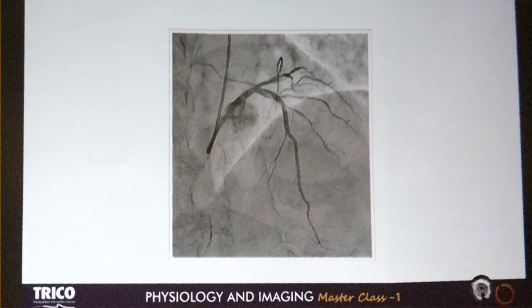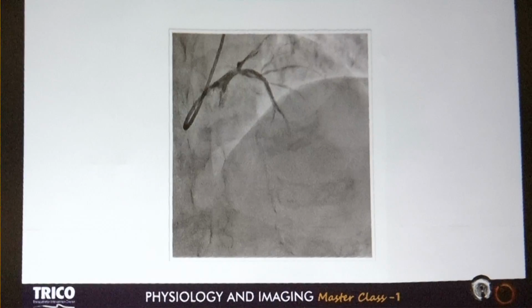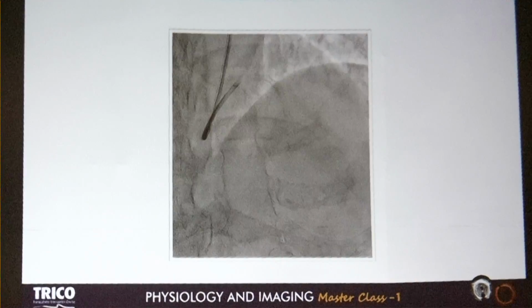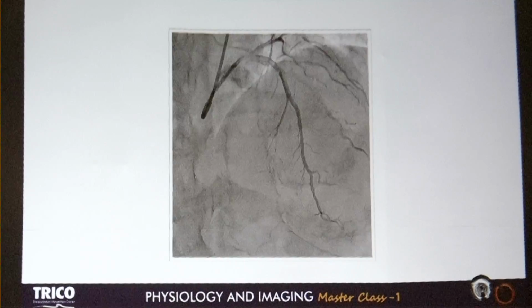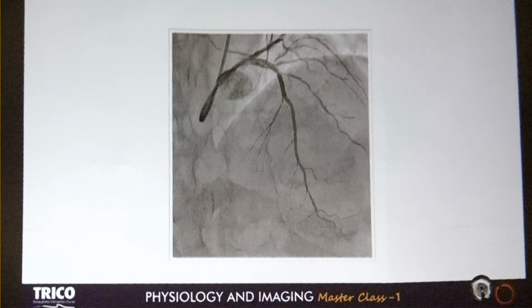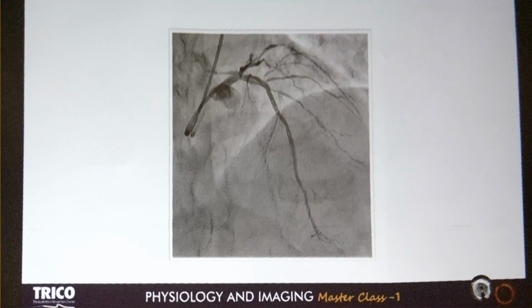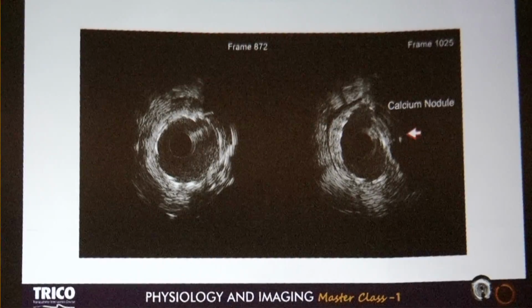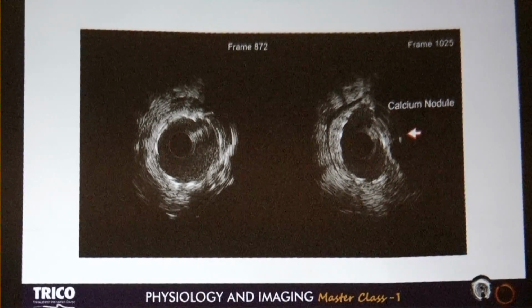Calcification? We have already done a lot of demolition of the calcium everywhere. Dr. Patel, as you commented, your wire came out after rota and then you again. No, after the first time, before rota, the wire came out and I had to go on otherwise. And even otherwise, if the wire comes out and I go through the wrong channel, the artery will occlude by now. So then I thought, let me use an IVUS catheter because it has a little better muscle. The IVUS catheter entered with difficulty, and this is what it is, a calcific nodule.